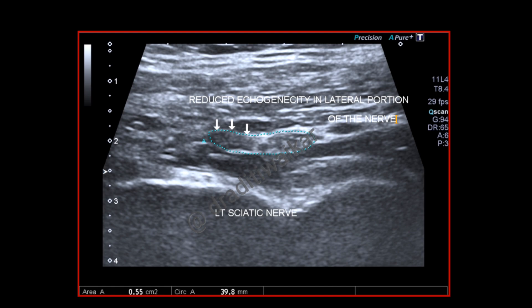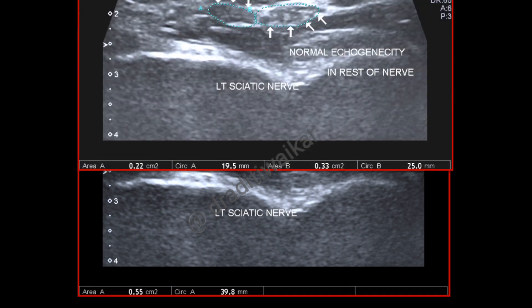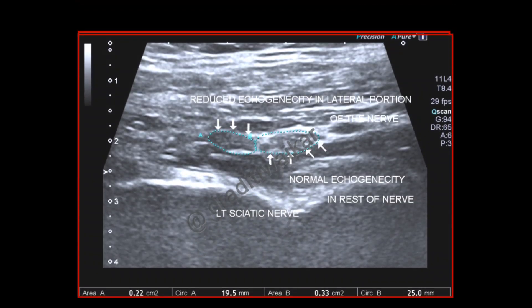This is a zoomed image which again delineates the loss of polyfascicular pattern in the lateral portion, with smudging of fascicles and complete effacement of interfascicular perineurium, whereas in the medial portion the polyfascicular pattern is very well maintained.